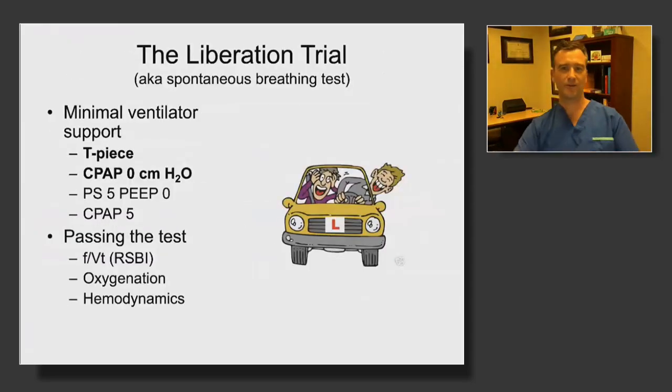So how do you do a liberation trial or a spontaneous breathing test? Well, you can think of it as kind of like a driving test. You sort of put the person in the car and see how they do. Basically the concept is that we reduce the ventilator support to the absolute minimum and see how they respond. Can they tolerate the work of breathing without support from the ventilator? Can they maintain adequate oxygenation without support from the ventilator?